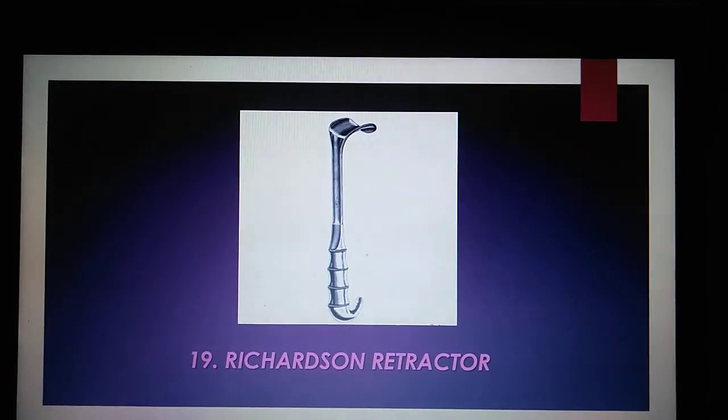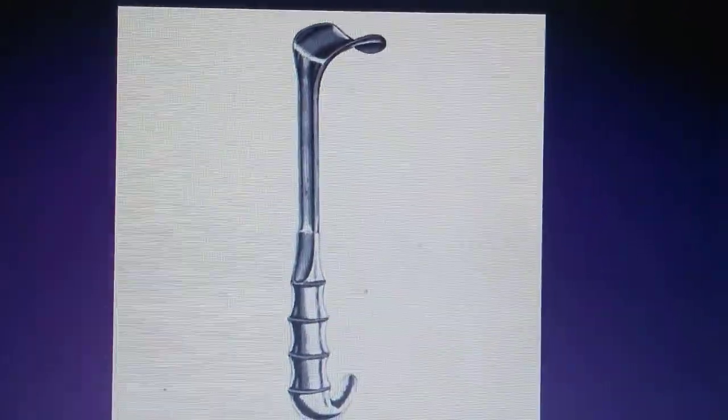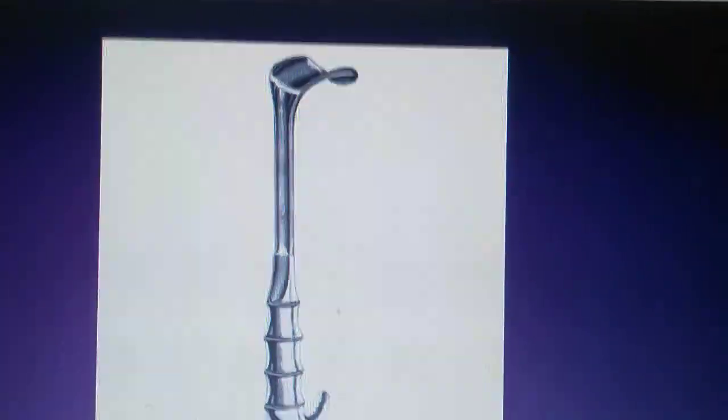The Richardson Retractor is a long retractor that can be used during procedures such as chest or abdominal surgery to grasp soft tissues using the curved blade.